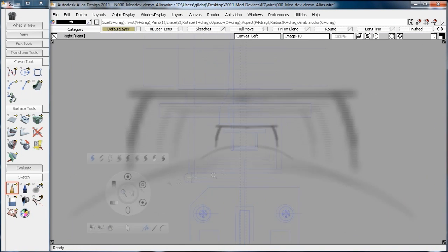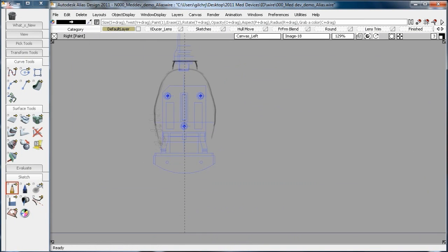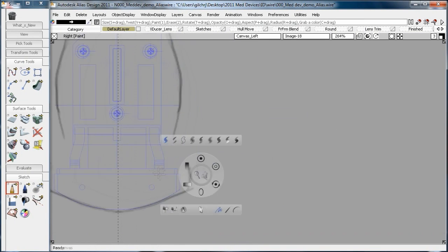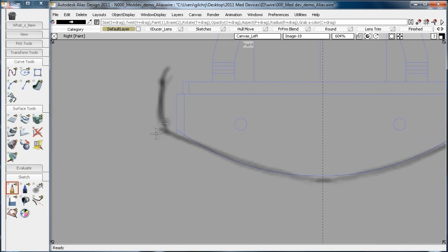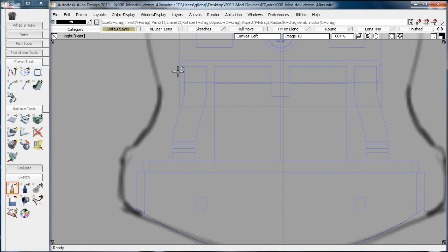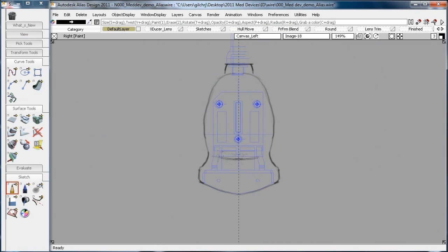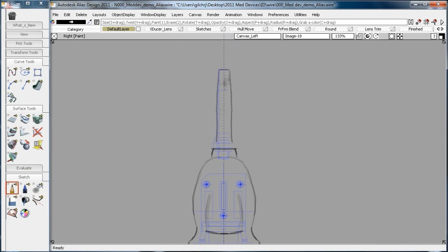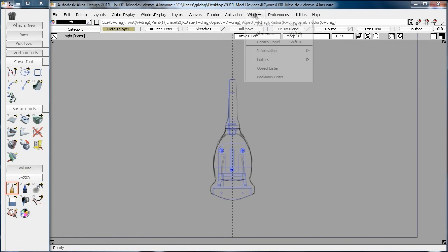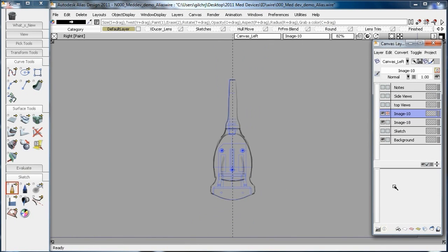Digital prototyping is Autodesk's approach to enabling our customers to design, manufacture, and market the world's best products. And it starts right here with Autodesk Alias Design in the early concept phase of this medical device.